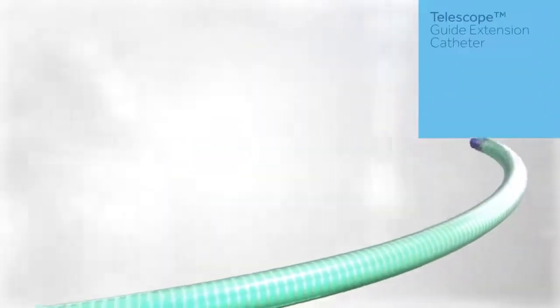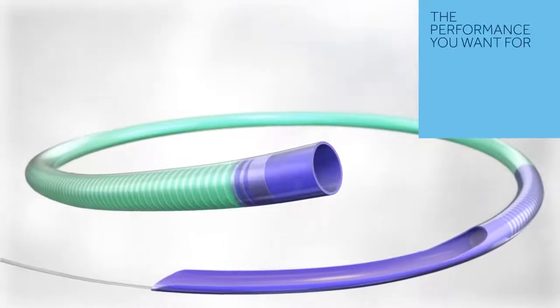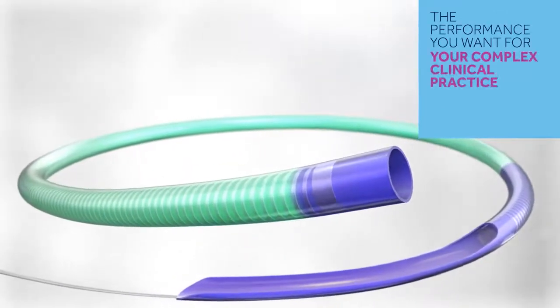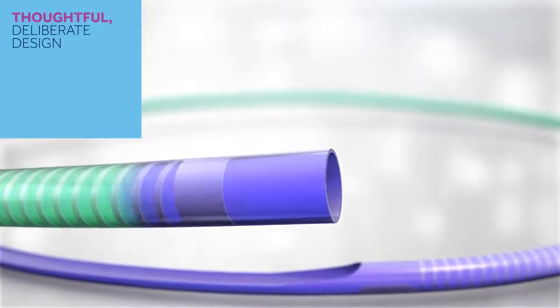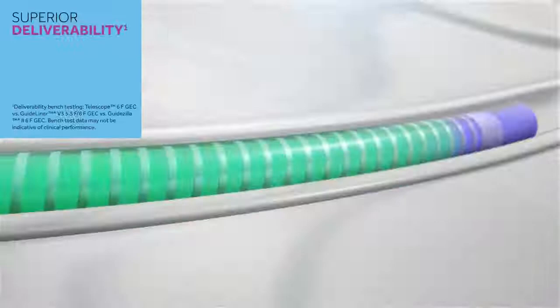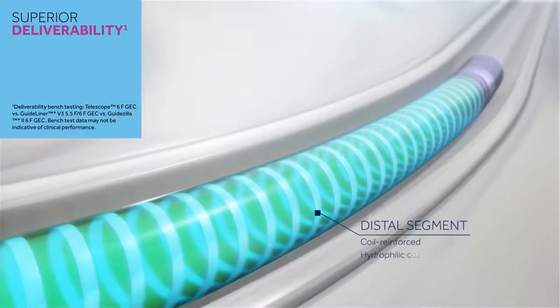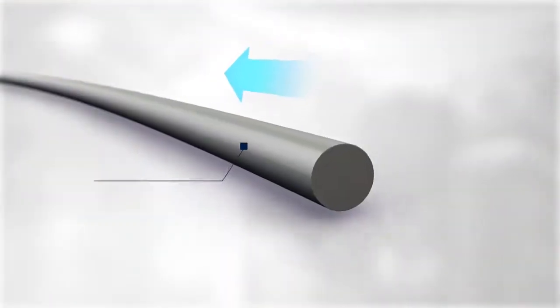The Telescope Guide Extension Catheter pushes past the ordinary, delivering the performance you want for your complex clinical practice. With a thoughtful, deliberate design, Telescope GEC features a coil-reinforced hydrophilic-coated distal segment, contributing to superior deliverability.